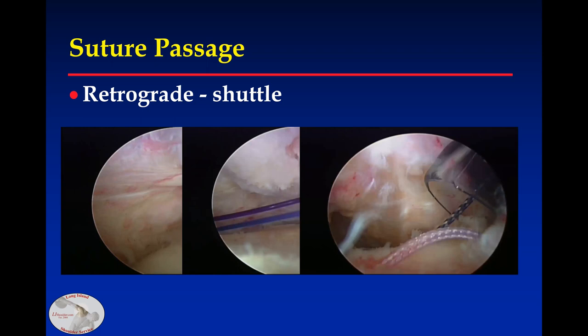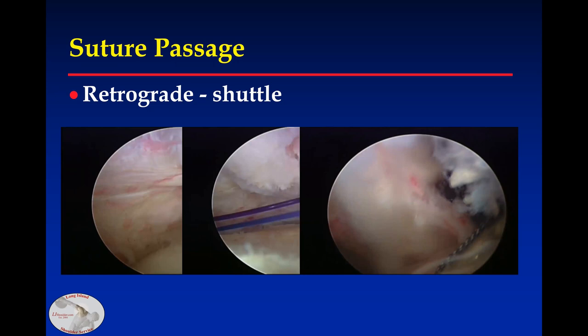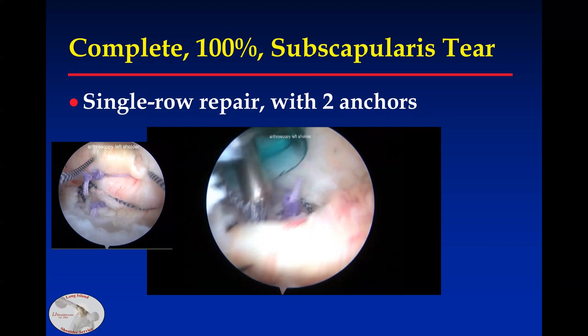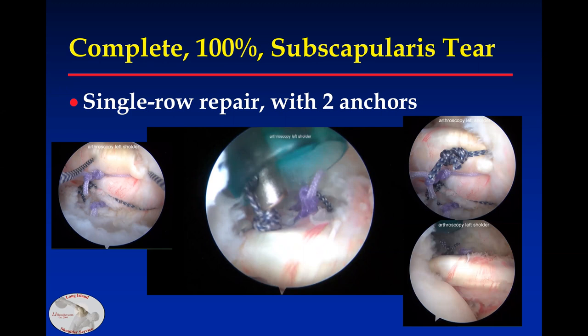I'm using a 30-degree scope, so it is fairly easy to see. Here's another case showing the knot being brought down, and you get a nice repair viewed from the anterior portal and from the posterior portal after the half hitches are placed.